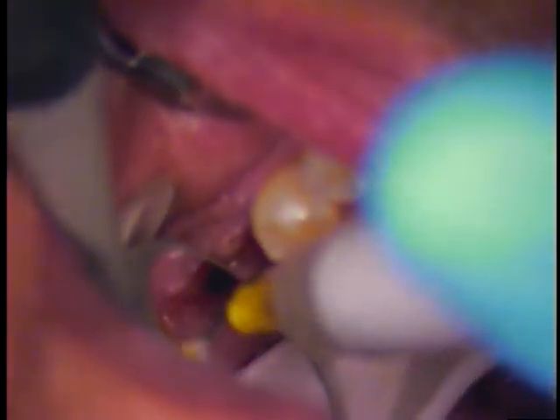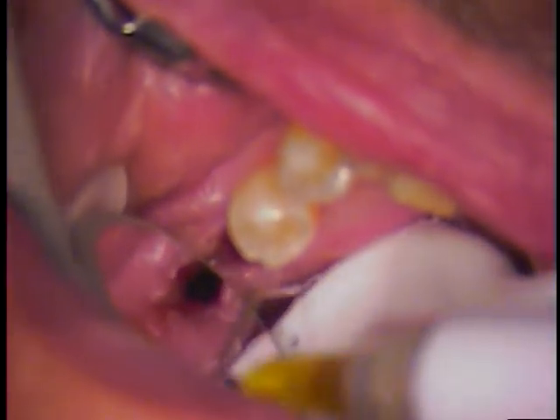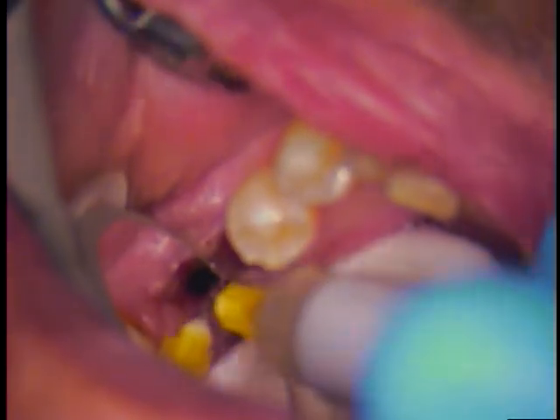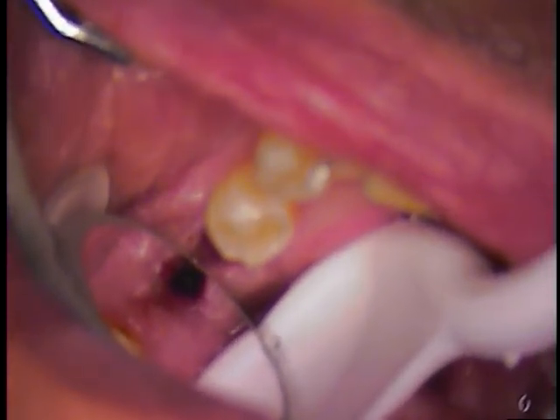So here we go. Time to clean house. We got a healing abutment to put in there. So isn't that great? Now we can go in and identify, is that everything in there or what's beyond this now? Let's see what else is down in there for us to look at now that the head of the screw is out. Huh. We got other things in there. Interesting. Stuff that's down in the threads. Let's find out what they are.